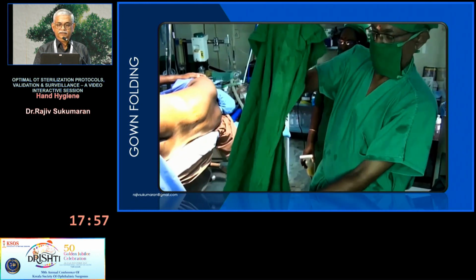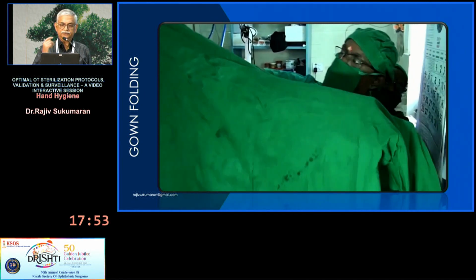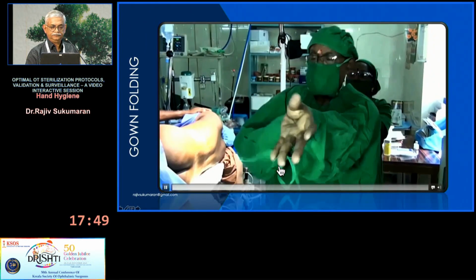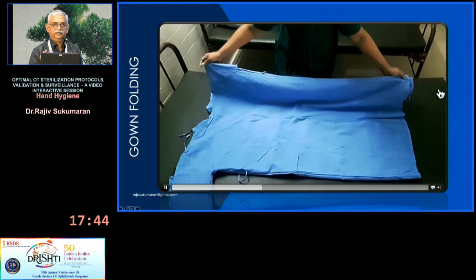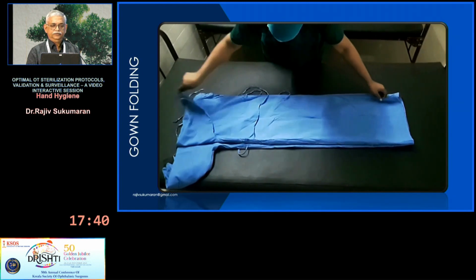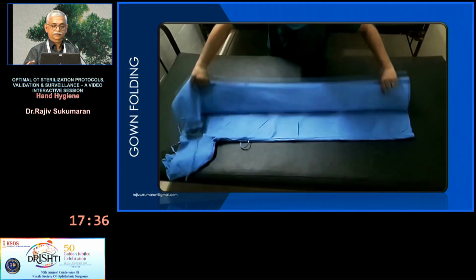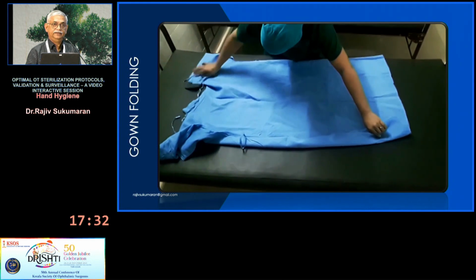So, he is wearing. There is a proper way of folding the surgical gown. Look at this. This is the way it has to be folded. So you spread it around, fold it into half, fold the back portion into half again.